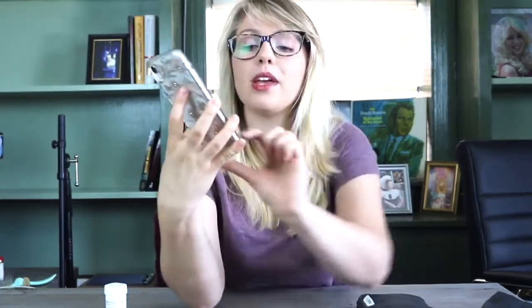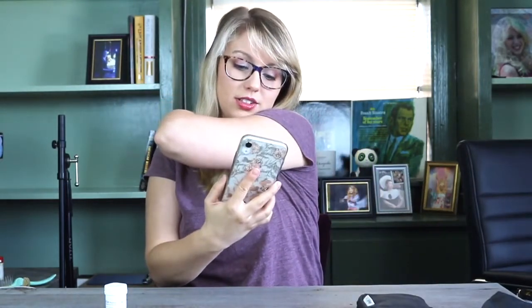Let's do a swipe with our handy dandy Freestyle Libre. I'm going to unlock my phone, go to my Freestyle app, and then you click 'check glucose,' and then I'm going to scan the sensor — and it's a little off. I'm actually surprised because this sensor has actually been pretty accurate. It says I'm 103 and stable, and I'm actually at 77, so it's off by about 30 or so points.